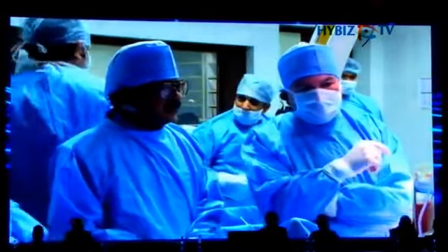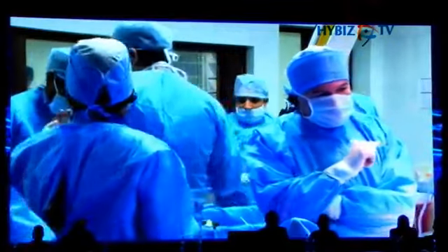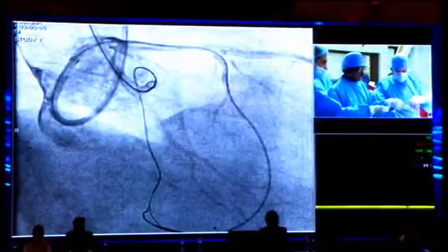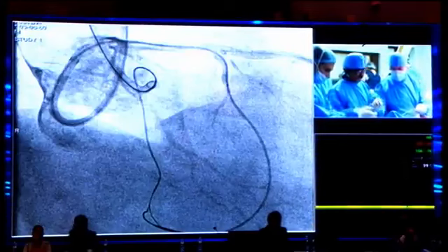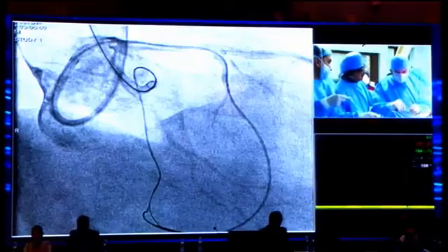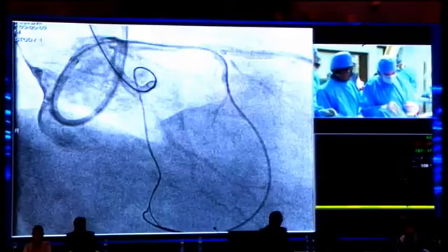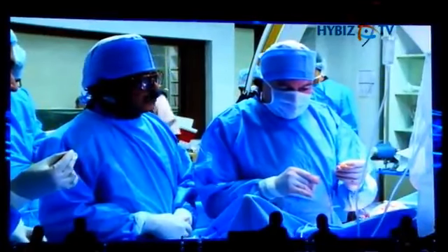My preferred wire in this position for retrograde would be the Ultimate. It's Dr. Werner's choice, if he wants, because I don't do a directed CART yet. If you don't do directed CART with a balloon, then I would use Gaia from retrograde. But if you are still working in the true wire crossing idea, then I would prefer the Ultimate.